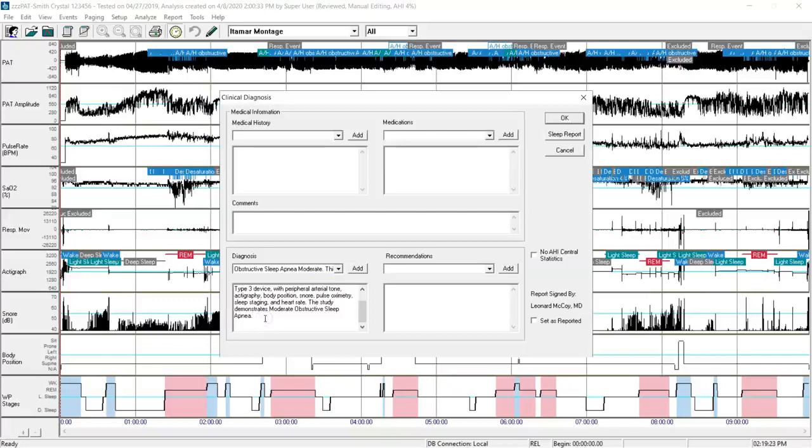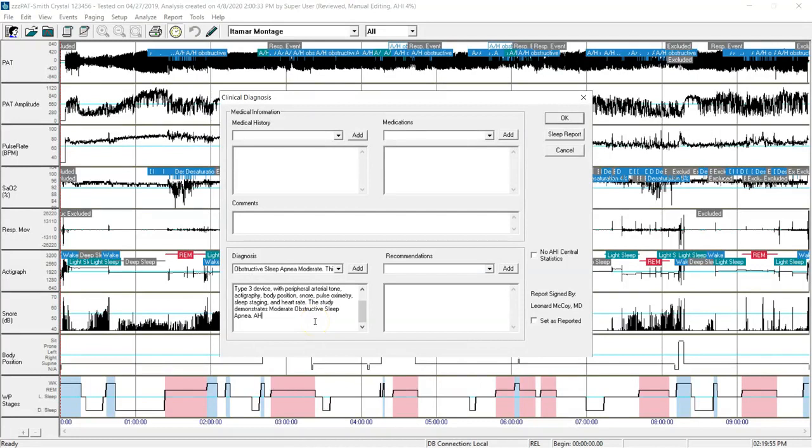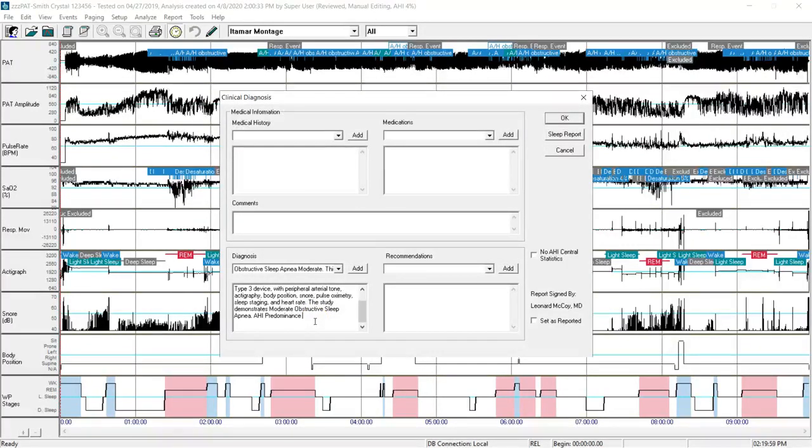Again, you can free type in this area if there's additional information that you want to put in for her. I will type in AHI predominance and REM.